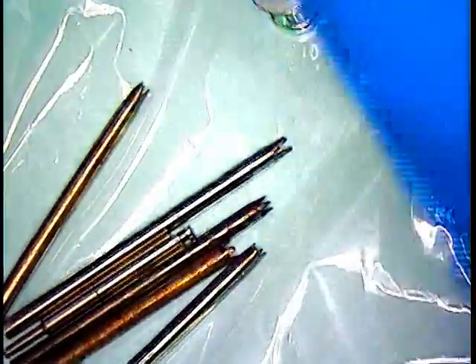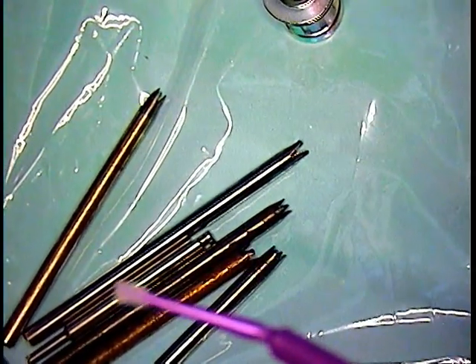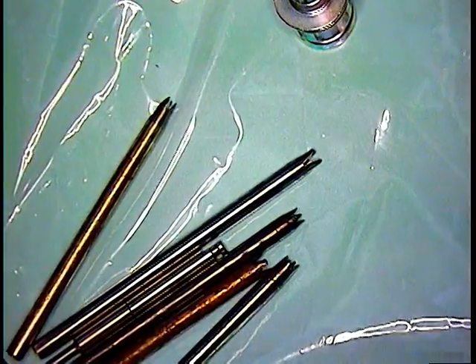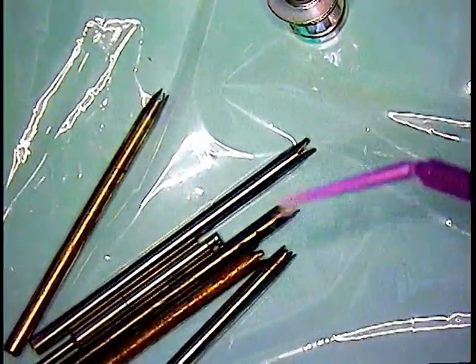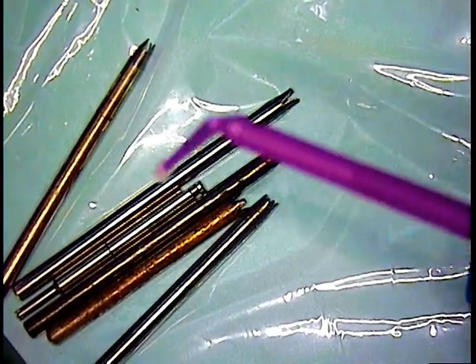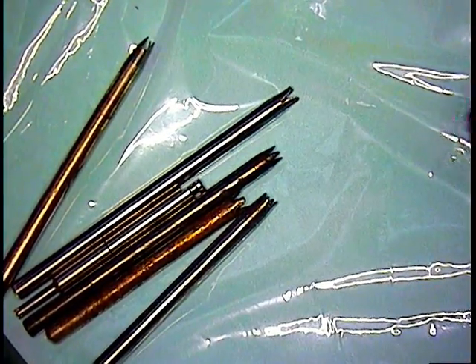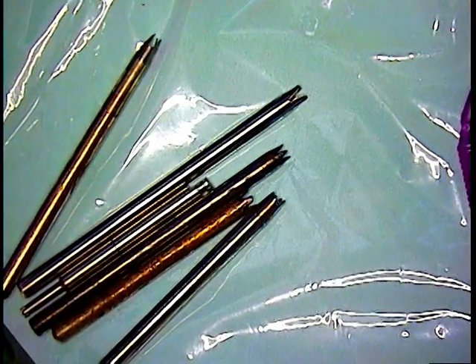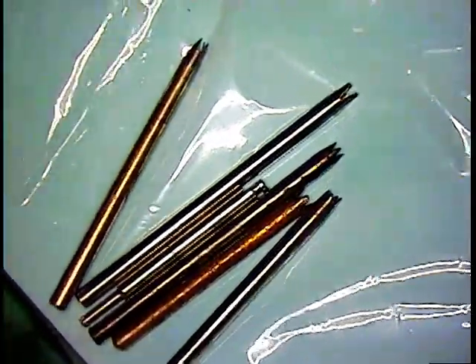We went through a process of uncovering the implants with the diode laser. We also used some pre-soaking materials that we put together. And now we're moving on to actually getting the implant fragments out. These are custom-made instruments that I've come up with that will remove a fragment. They're all different sizes and shapes, and some of them you can actually buy from your implant companies. But bottom line is, if you don't have the right size, you have to develop your own instrumentation. So that's where we are right now. We're ready to get these little guys out of there.